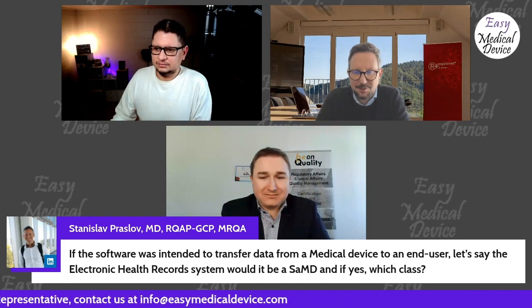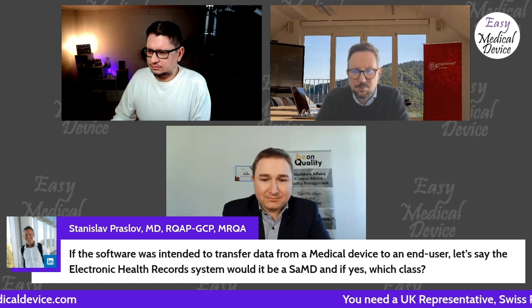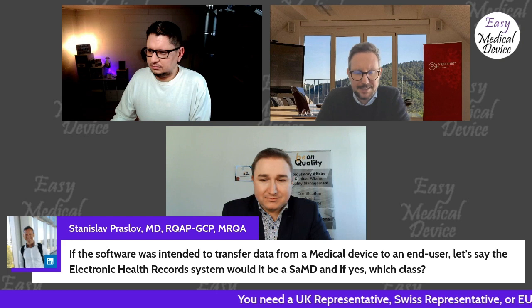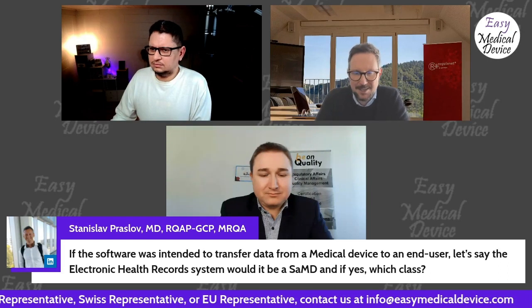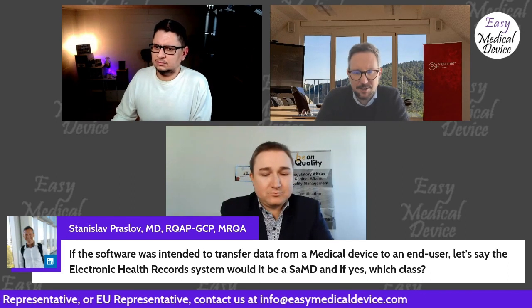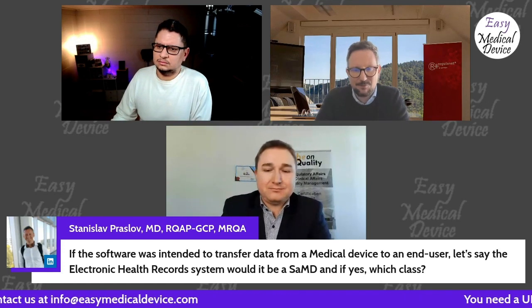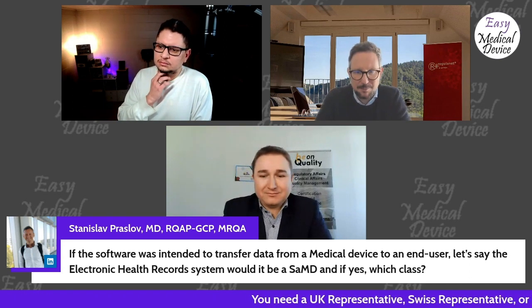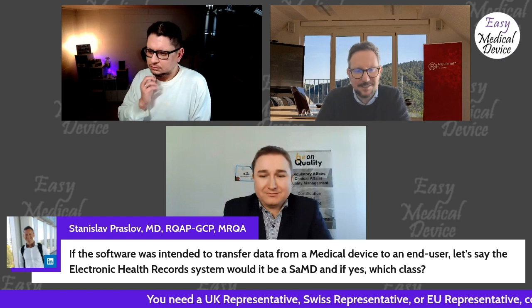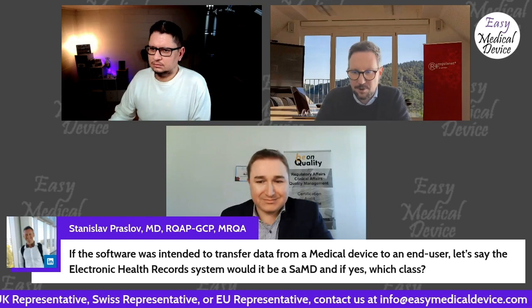There are sometimes medical device software products out there that do not have a user interface. They're just backend algorithms. That's possible, but they still do something with the data. So if it's purely transferring data, like a pure electronic health record system, it is not a medical device because it's just the same data as it gets from somewhere. But as soon as it does something with it, like interpreting, aggregating for medical purposes, then you get into this kind of framework.